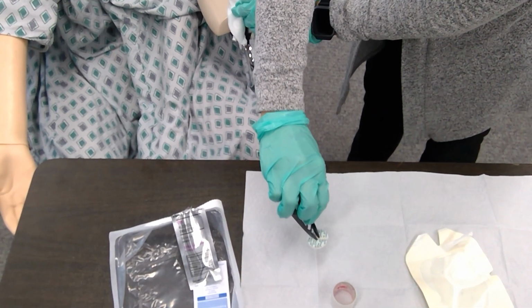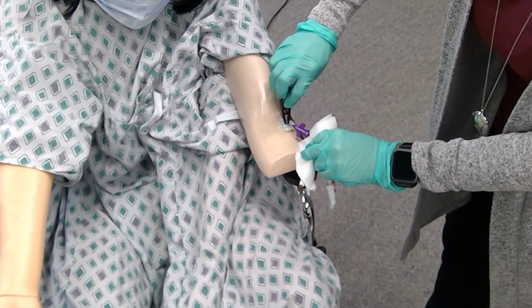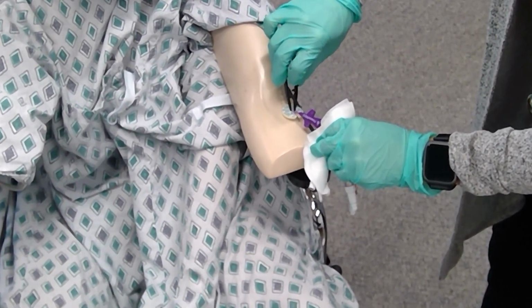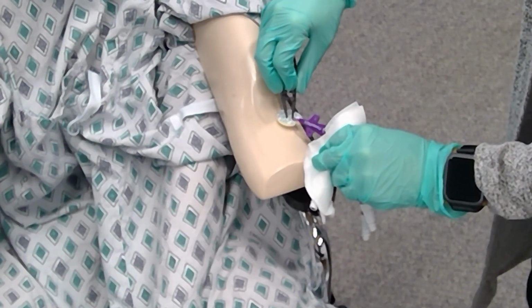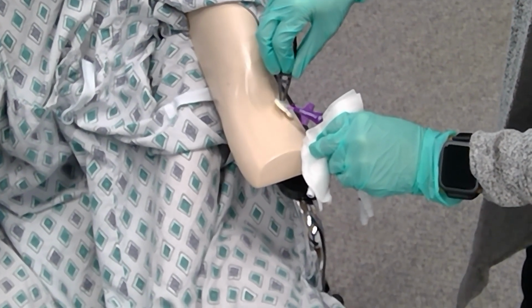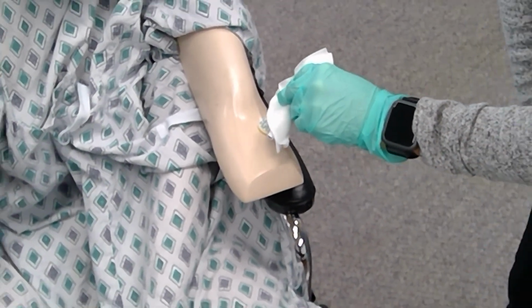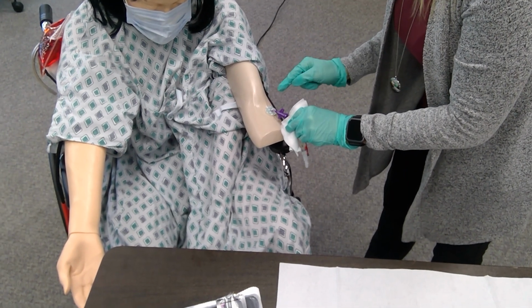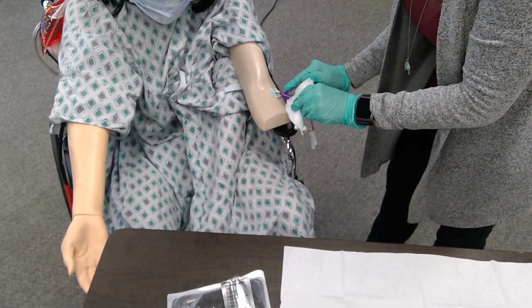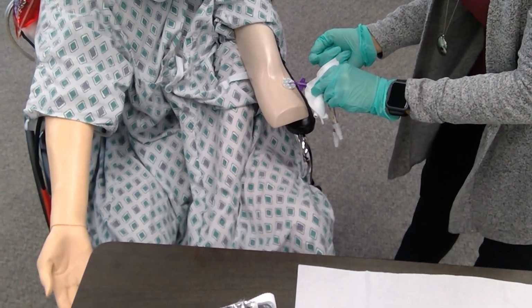I'm going to put it like this so that it opens, and I can come over here and slide it on my tube just like that. One other thing that you need to think about when you're doing this dressing is the line needs to set on top of that slit of the biopatch.